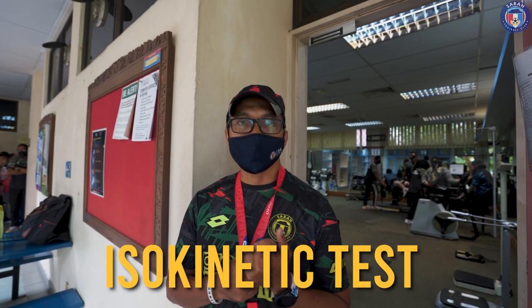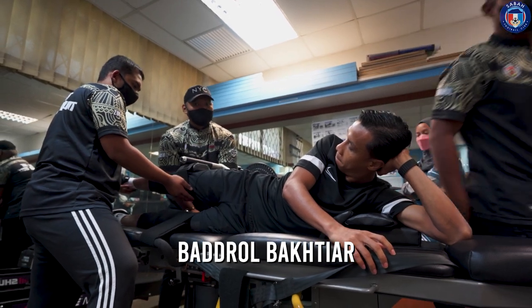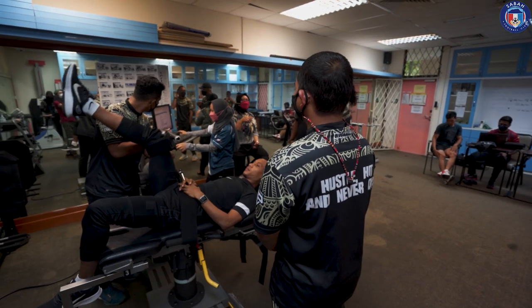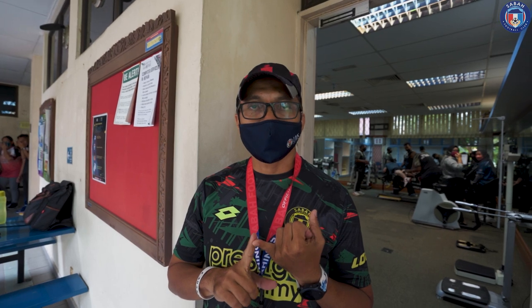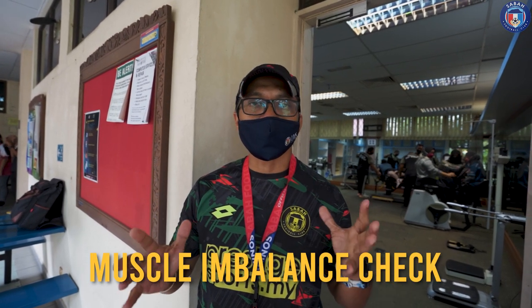Selamat datang ke Pusat Kecemerlangan Science Sukan. Hari ini kita akan buat isokinetic test kepada player kita. Hari ini kita ada board role dan kita ada result — mereka akan test. Kita akan dapatkan data dan serahkan kepada kerja latihan untuk melihat prestasi mereka. Tujuan data hari ini ialah kita akan melihat dari segi muscle imbalance mereka, sama ada mereka stabil antara kedua-dua side.